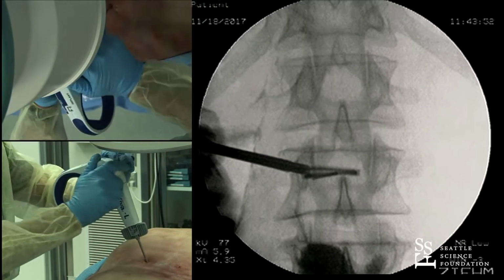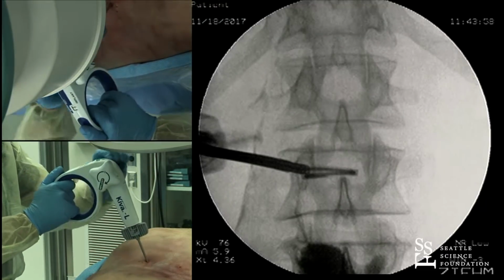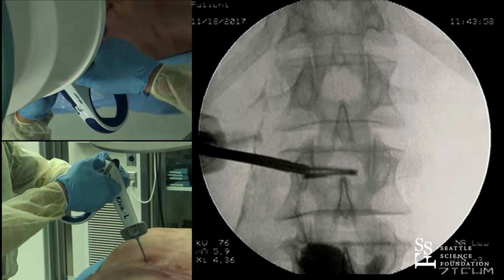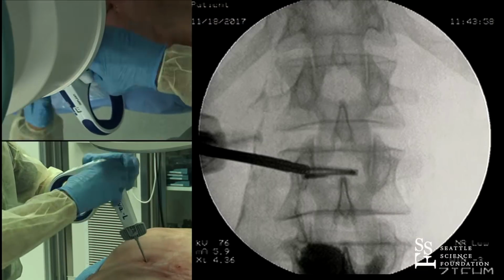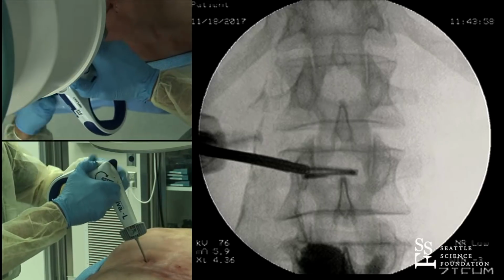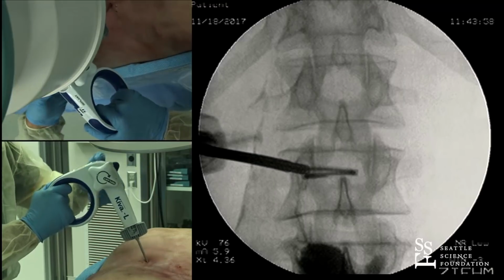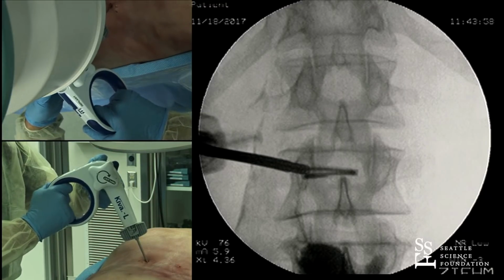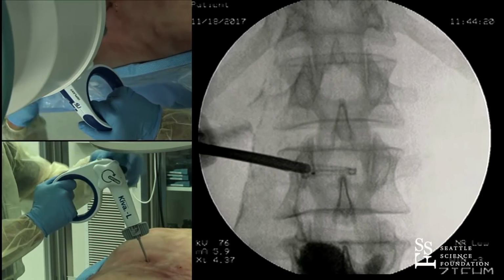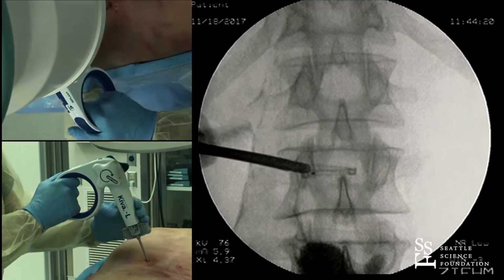Let's see, get some implant out, pull the coil back. And once the cement is hardened, it has an indicator that I'm watching. So whenever the coil goes all the way back inside the housing, you can tell it's inside. And that is the implant's marker, that little tantalum radiopaque marker.